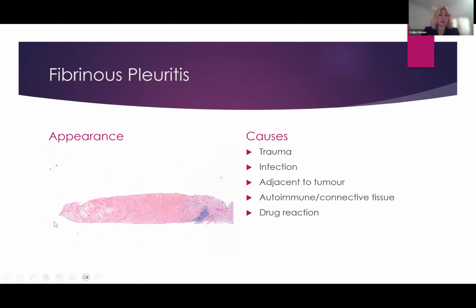And this will be the pleural surface over here. And this is all fibrin or sort of clotted material. And this adheres to the fibrous surface of the pleura. And then this gets expanded and you get this inflammatory infiltrate. And you can see just how thickened this pleura is compared to the previous example. So on imaging, you'll be seeing quite a thickened appearance. So when we say a fibrinous pleuritis, because of the many causes, there's not going to be many other clues. If there are other clues, it'll usually fall into a separate category, whether it be granulomatous or etc.